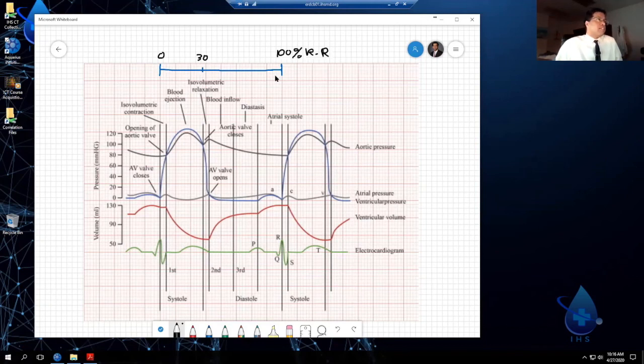The heart is still moving faster than the best CT scanners around. Even the dual source and the Siemens Force scanners are still just slower than the heart is moving inside the chest. So as a result, not all of the phases of the cardiac cycle are helpful for us because they don't all freeze cardiac motion for us to be able to see the coronaries very well. So what you got to do is you got to basically memorize which are the phases of the cardiac cycle that are most helpful. So where would you guess the most helpful phases of the cardiac cycle in percentages are?